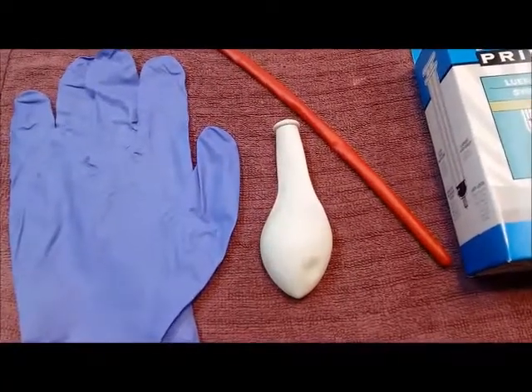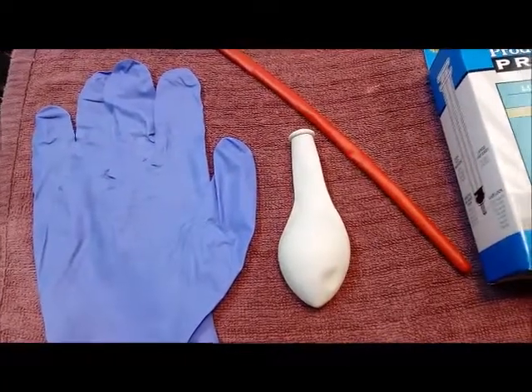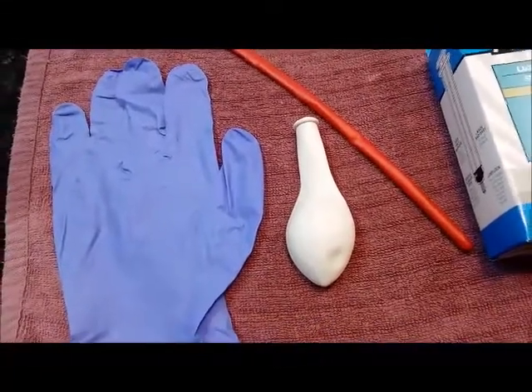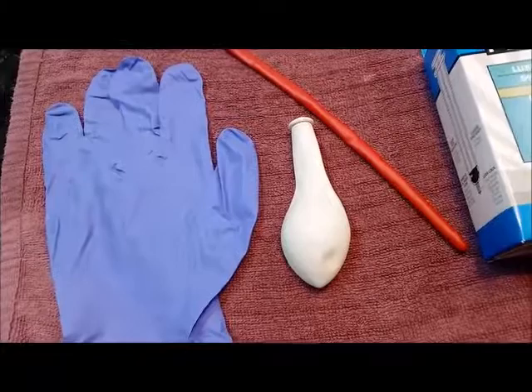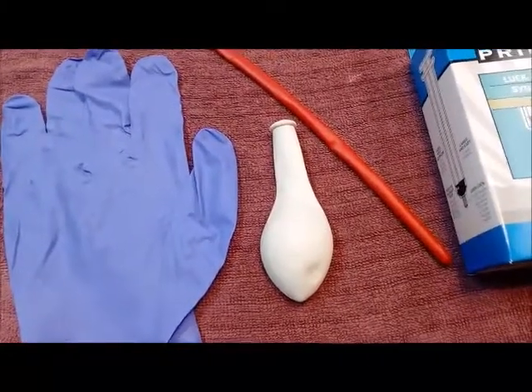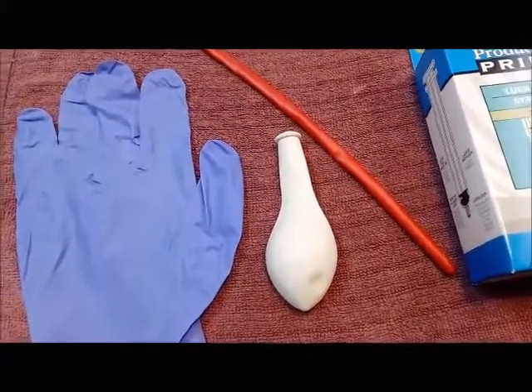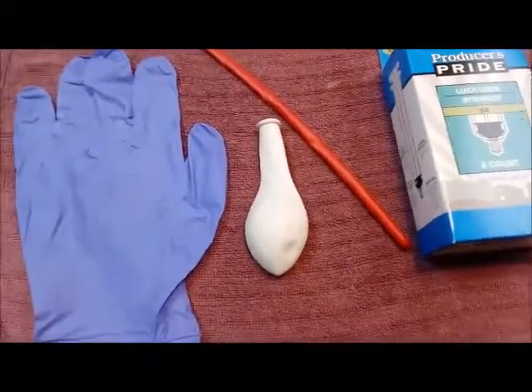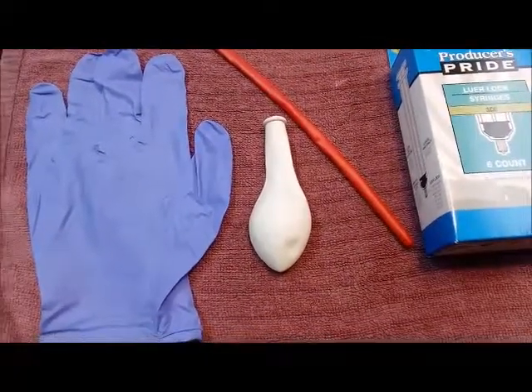Hey, it's your friendly neighborhood puppy chaser. This video I'm doing for my shelter staff. It's good for vet techs, animal control, pretty much anybody if you're going to need to poke at all. This is kind of a quick little tutorial on if you can't practice at your work and you want to practice at home.